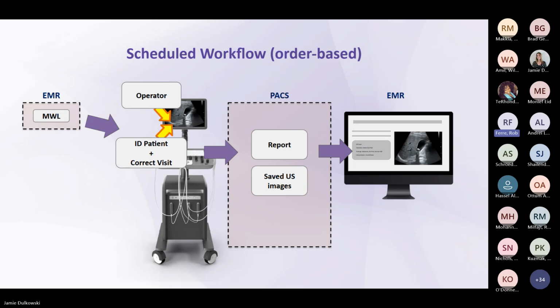And so an encounter-based imaging workflow is what works best for us. I actually did some surveys from our 1,500-plus members in our emergency ultrasound section of ACEP and found that the vast majority wanted an encounter-based imaging workflow. And so that's what this describes. Next slide.